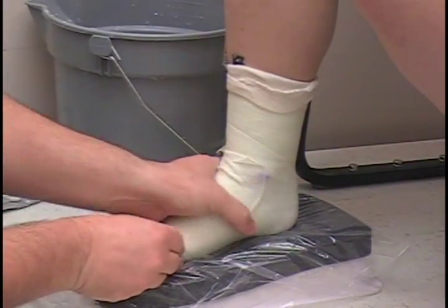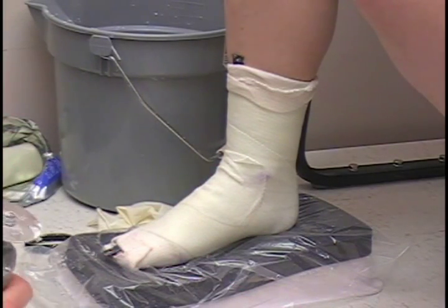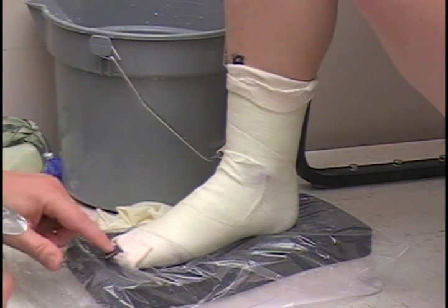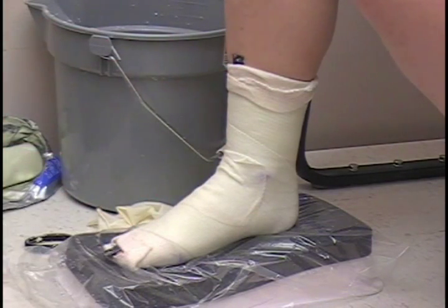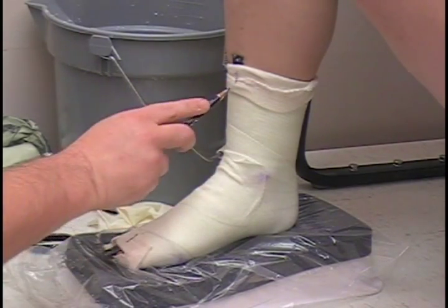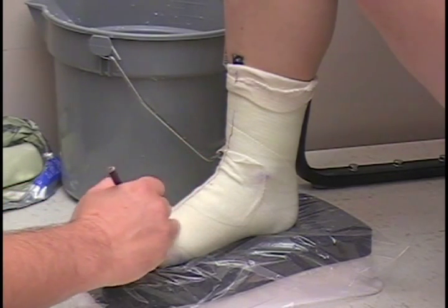All right, looks like it's pretty good, so we're going to go ahead and cut it off. On the casting saw, the blade does not circle — it goes back and forth, so it's very difficult to cut skin with it, but you can, so that's why I like to have the cutting strip here. Just follow the cutting strip down. If you're not real sure where it's at, mark on either end of the cutting strip right in the center, and then draw a line straight down — connect the two, and that's where the cutting strip is going to be.